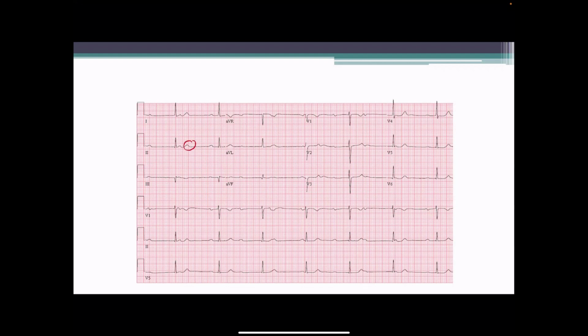So this is a P wave on its own, and then you have a P wave here with a QRS, and then a QRS on its own with a little tiny P wave here. So it's very disorganized, but you do have P waves and you do have QRS complexes. They're just not coming together. They're not coming after each other.